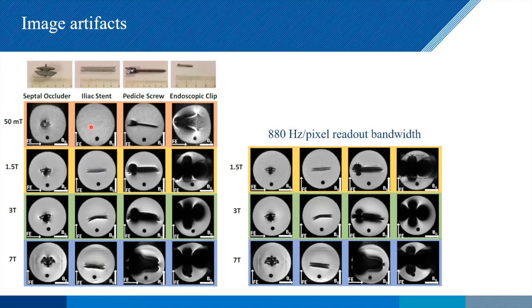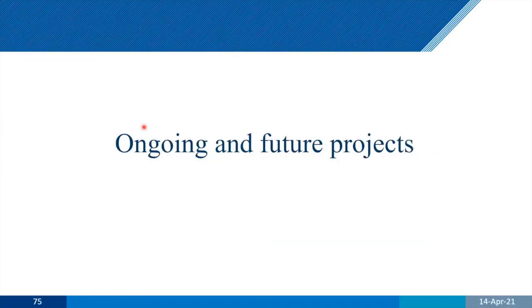So again, if you look at a screw, where it completely destroys over here, you can actually see the turns and the pitch of that screw at 50 millitesla. So this is nice again to be able to quantify, for ultimately using in patients with medical implants. So that's sort of the state of where we are.